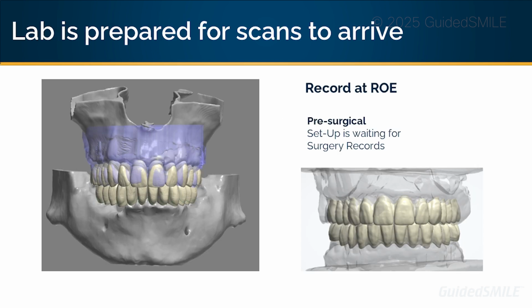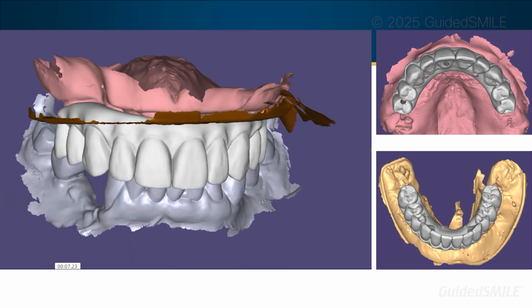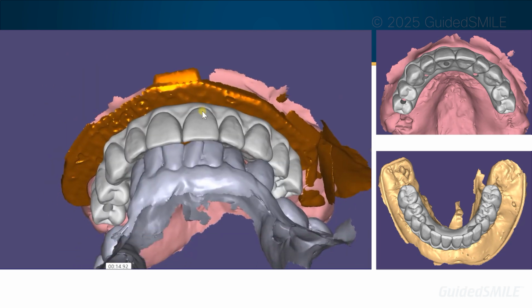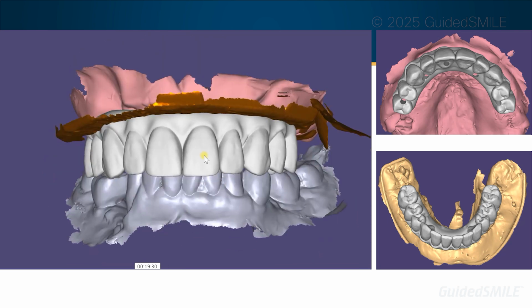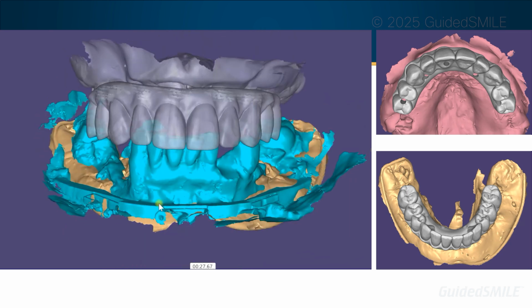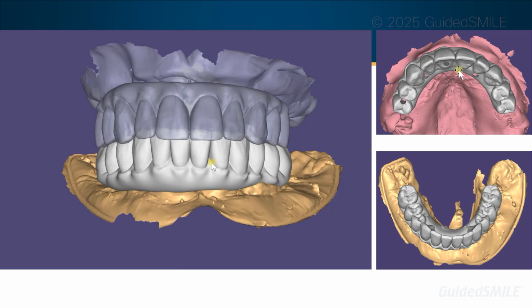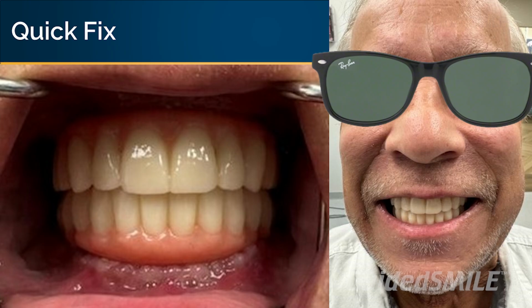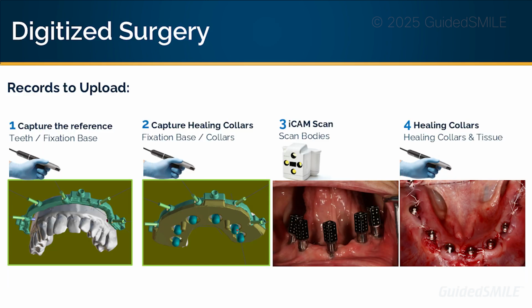Right. We go back and we grab the pre-operative setup that we designed, the beautiful teeth. And then, in this case, the doctor performed the upper only, or the upper first, right? So we made the prosthesis, doctor printed it, seated it, and used it as the opposing right here. Okay, now the prosthesis that we made is in the mouth. Use it as the opposing. There's the fixation base. That's the first scan. And then we went through the whole process and made both prosthetics. Here are the prosthetics on the right side. Voila. Nice job. And there it is, CombiGuide with photogrammetry.